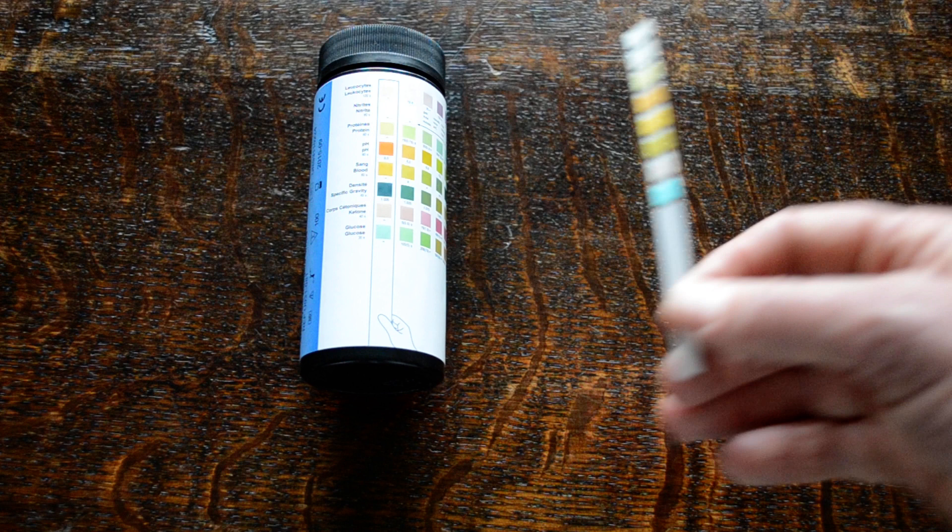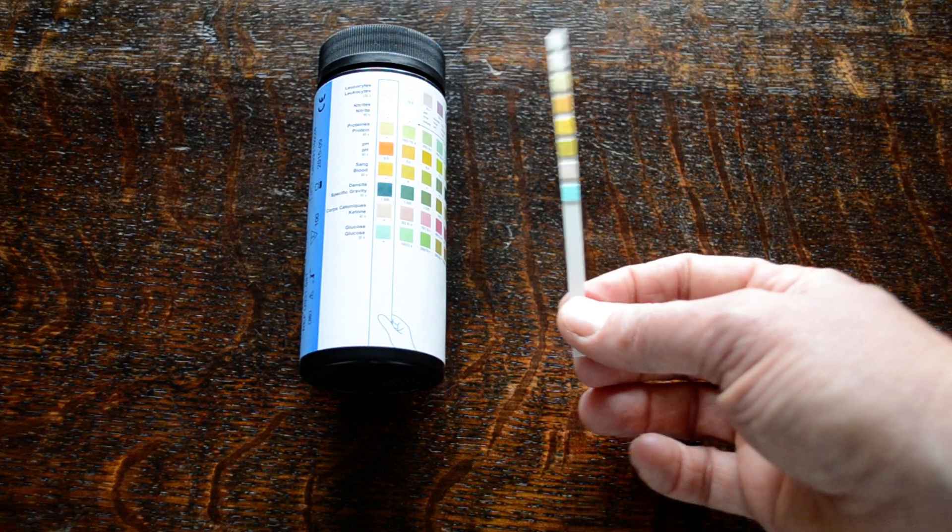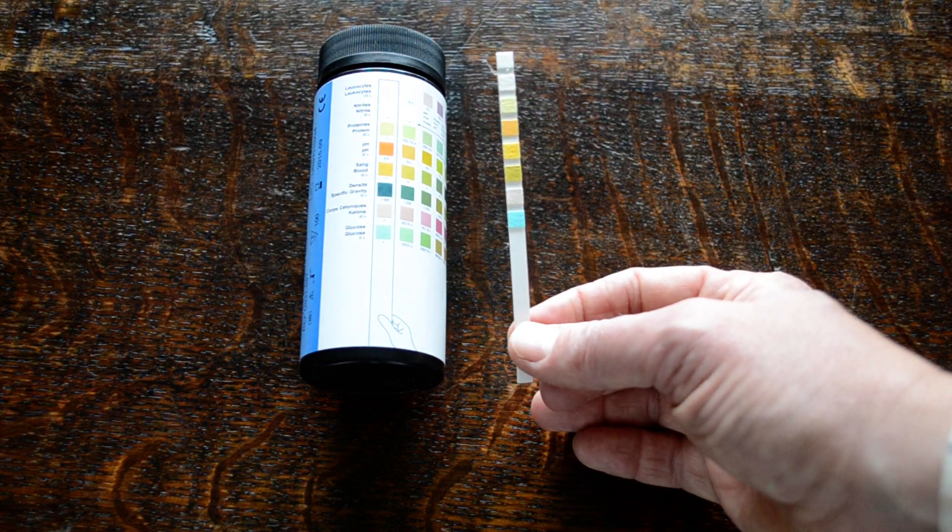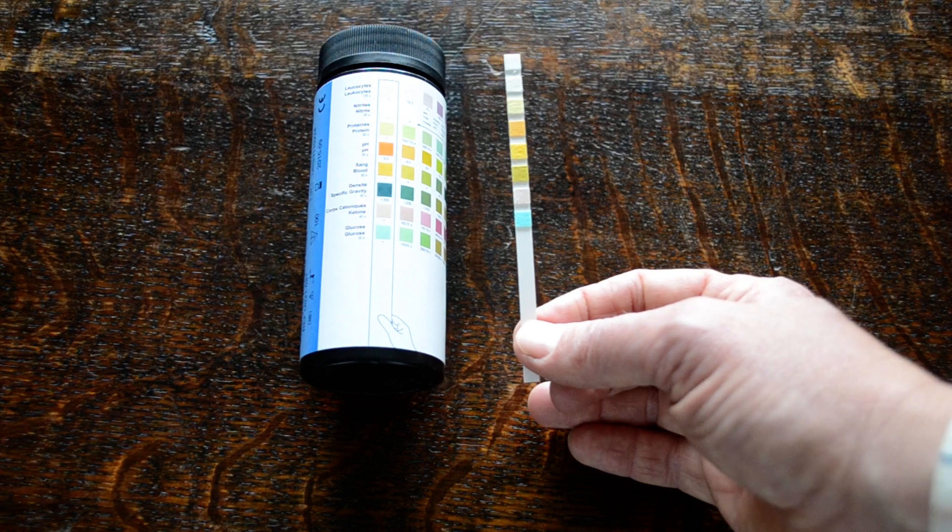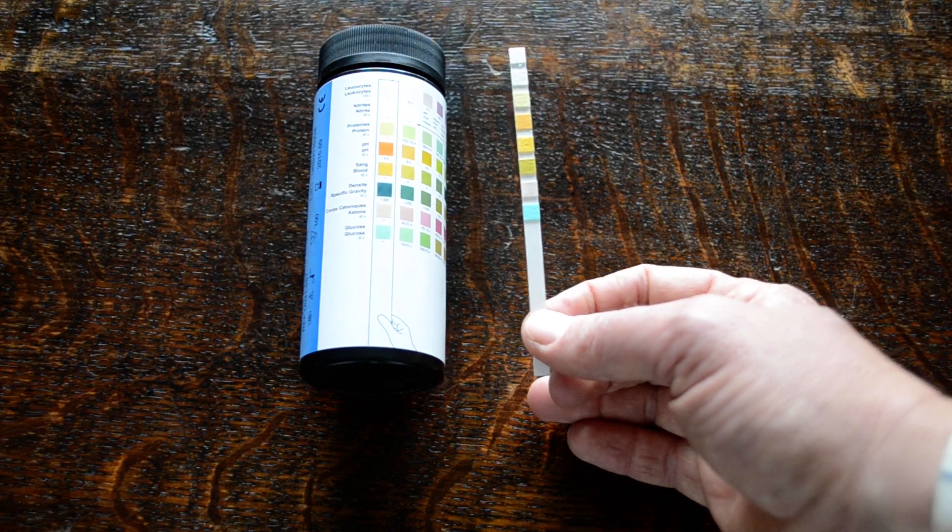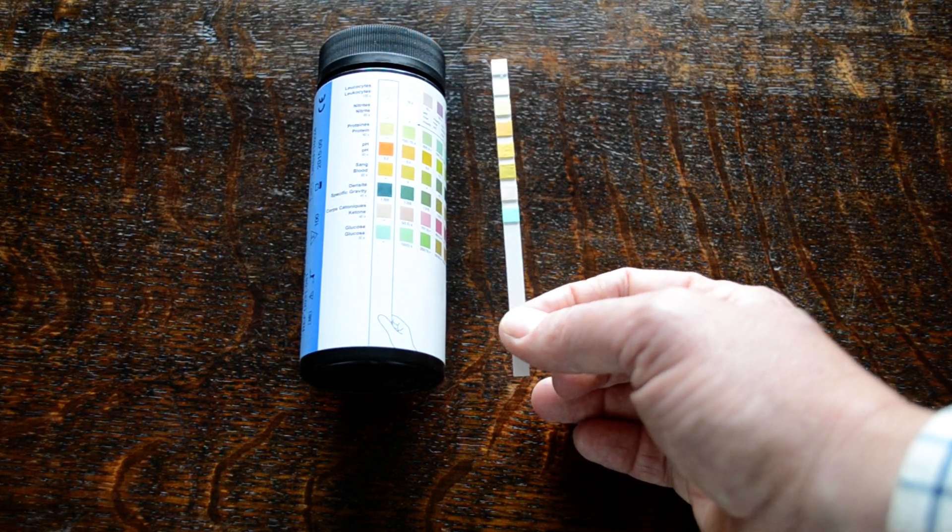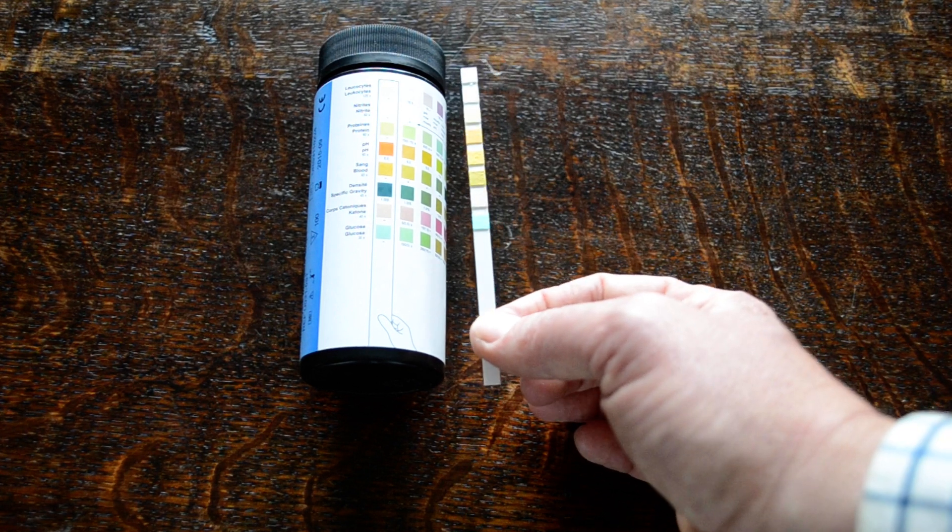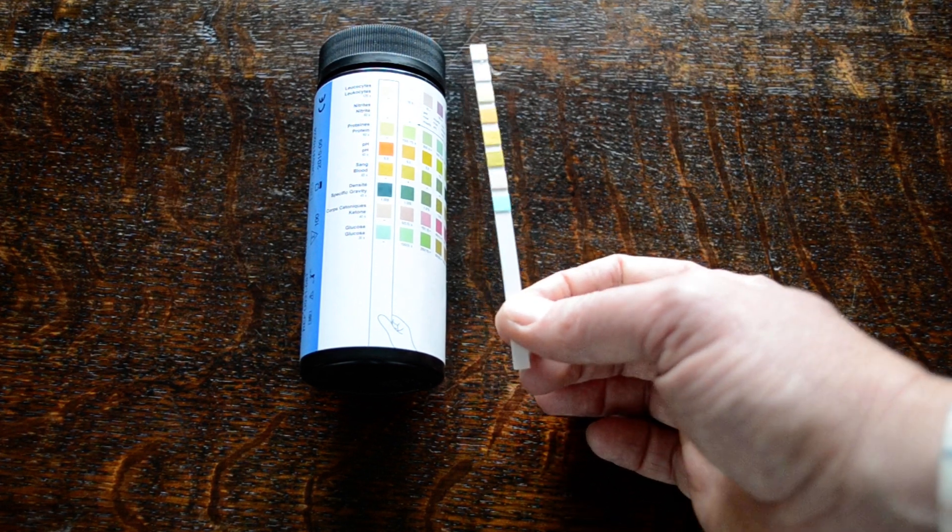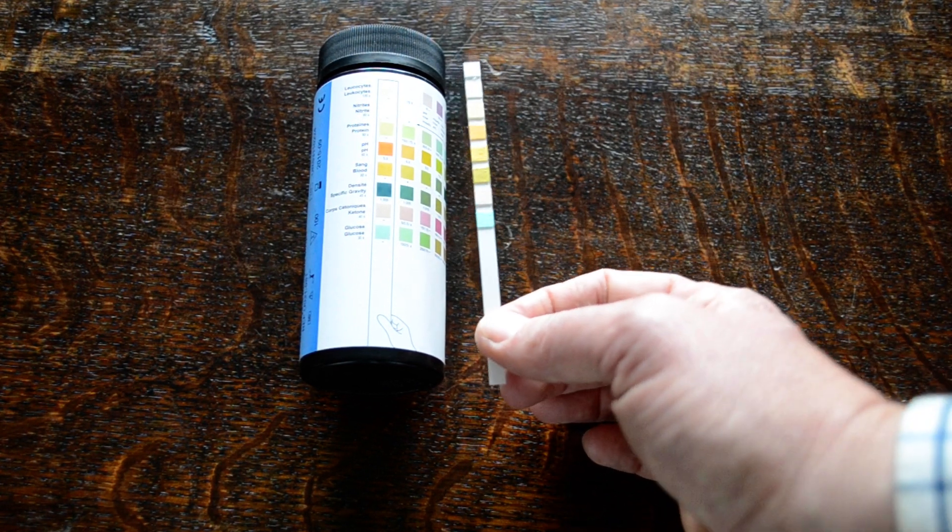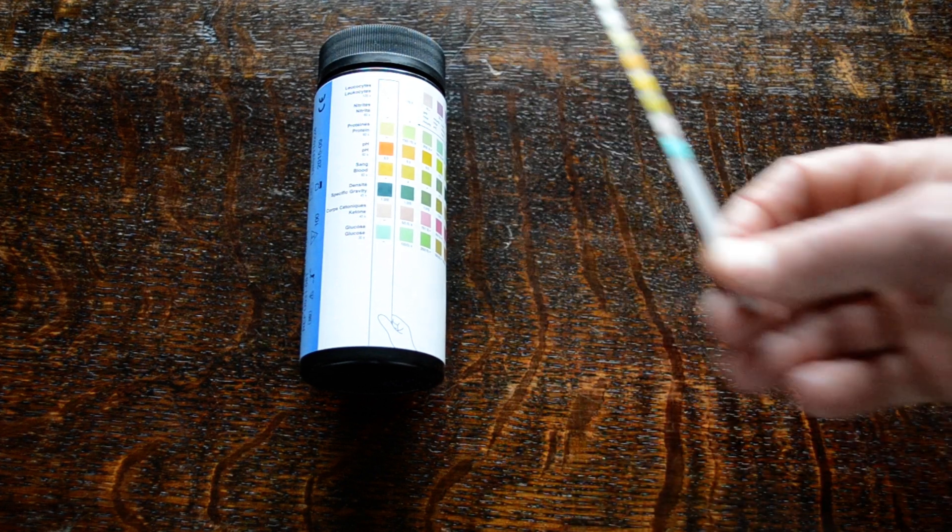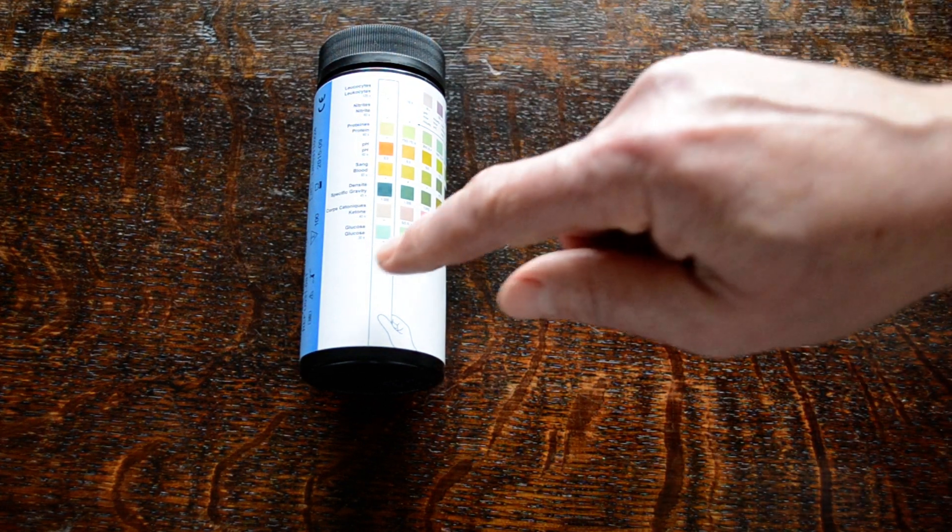Manufacturer's recommendations on all urinary tract and all urinary reagent analysis test strips is using within three months ideally of popping that seal. Beyond that, they may still be in good condition but they may not, so always check them before you do the test.